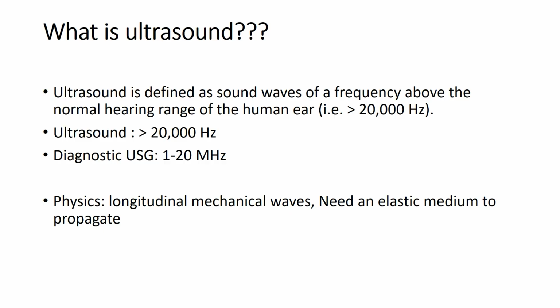So first of all, the definition: what is ultrasound? Ultrasound is a sound wave which we cannot hear, it is not audible. That means the frequency of the sound wave is more than 20,000 hertz.